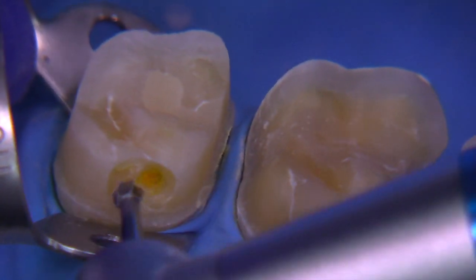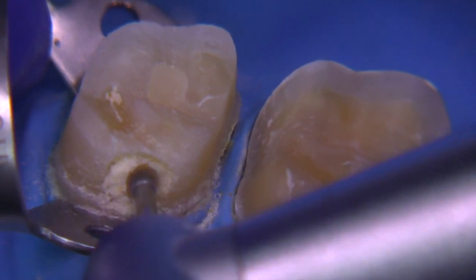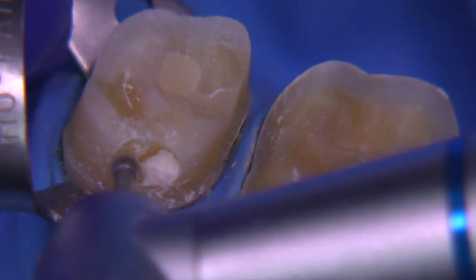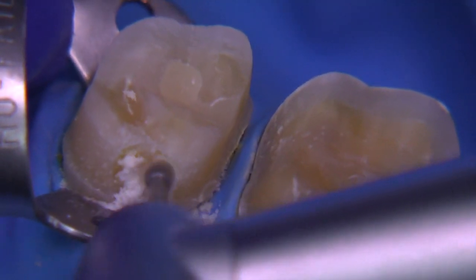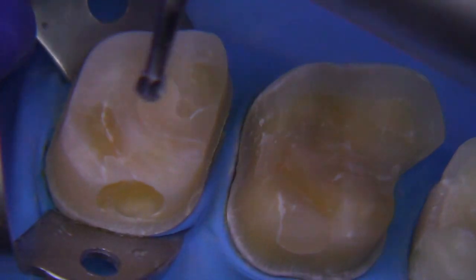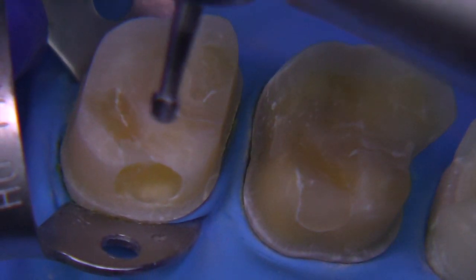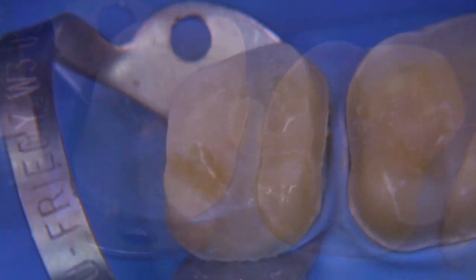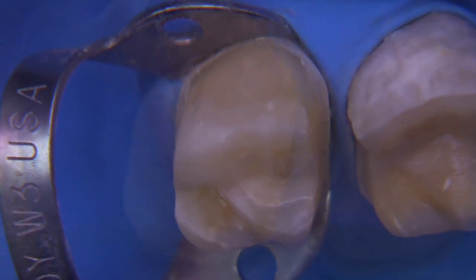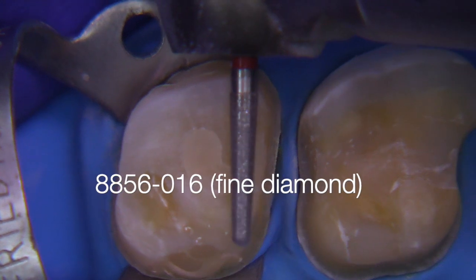After we do this, we can simply block it out with the material of your choice — you could use a glass ionomer, a flowable composite, or a paste composite. It really isn't going to make a big difference because this is going to be sealed inside of a well-fitting restoration that's going to circumferentially seal it. In a subsequent video I would talk about whether to bond it or use a regular cement or glass ionomer.